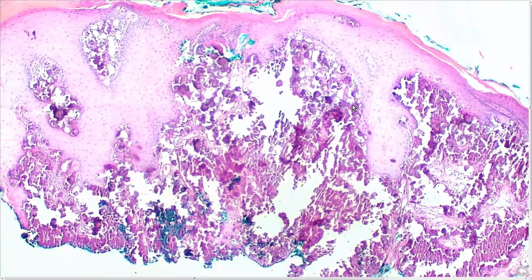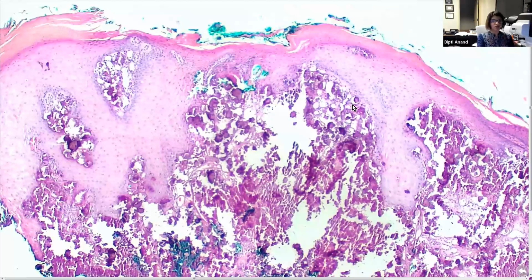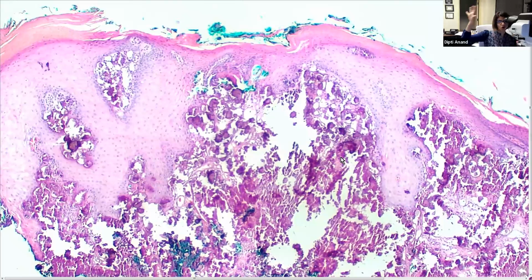Okay, this is the next one, 23. This is the one that I was talking about. So you have your idiopathic calcinosis cutis, tumoral calcinosis, and this is the third type. This is subepidermal calcified nodule. It most commonly presents as a chalky lesion on the face of a child, and what you basically get is pseudoepitheliomatous hyperplasia, and juxtaposed beneath it, you get this calcium deposition. Normally, you get calcium deposition with a normal epidermis, in the dermis or in the fat. In this condition, you get it right beneath the epidermis, and the overlying epidermis is hyperplastic.